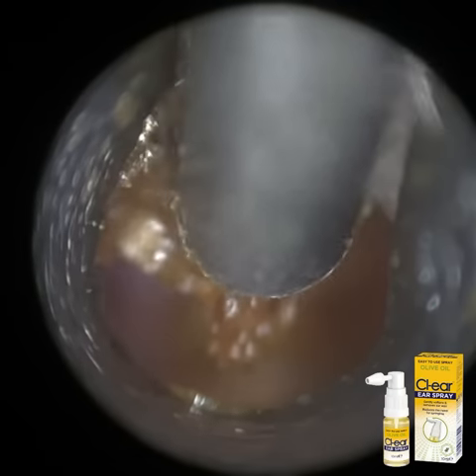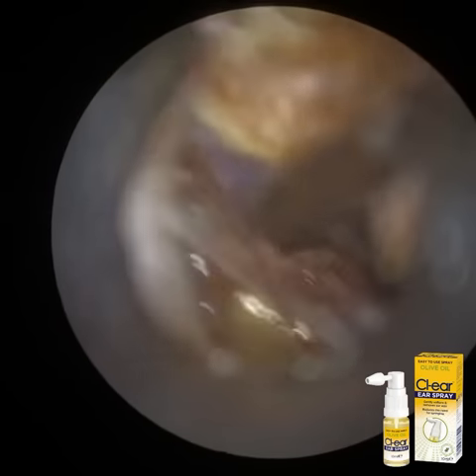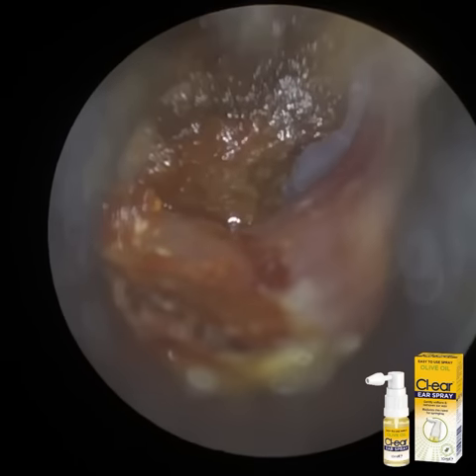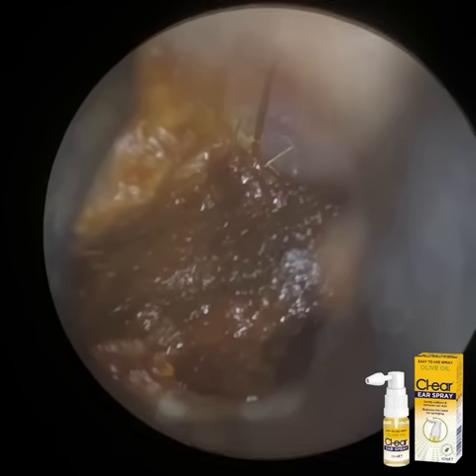In comparison with the iClearScope, the endoscope, in terms of the optics and views, in reality, there's nothing that can really compete against an endoscope because of the view it provides. It's a wide panoramic view. It's almost like you're in the ear. I will come back to that in a moment.